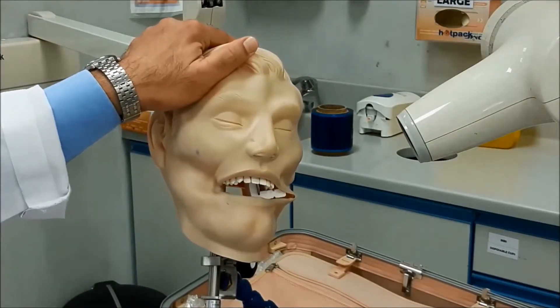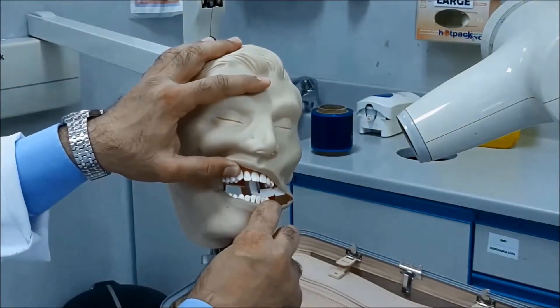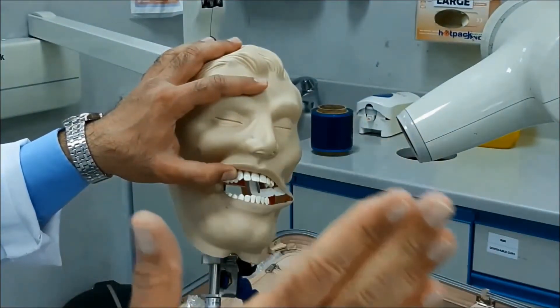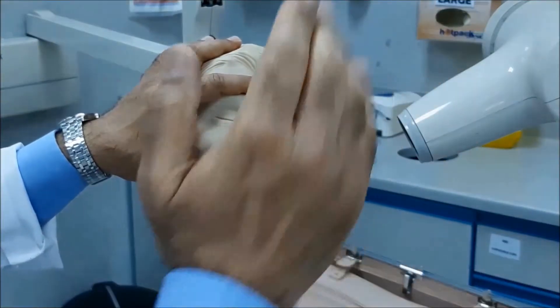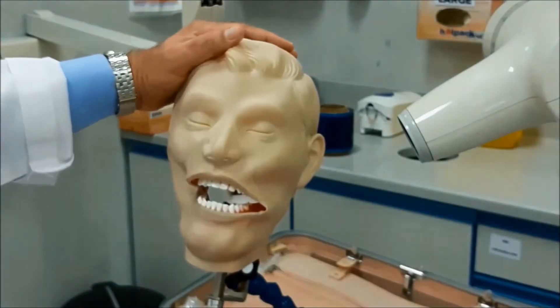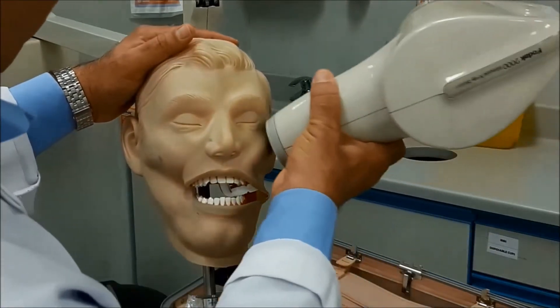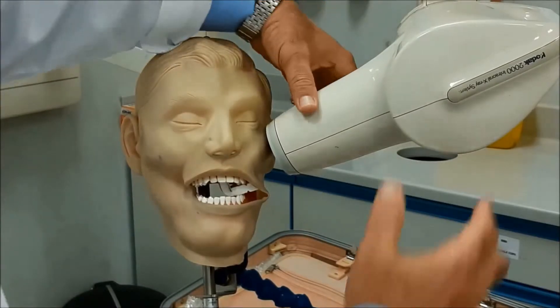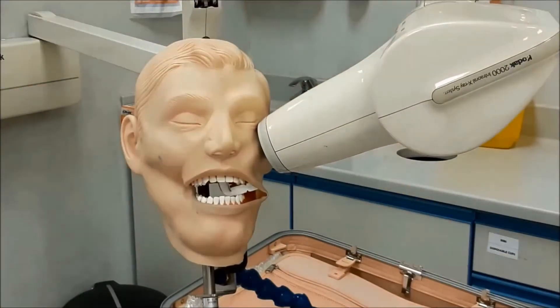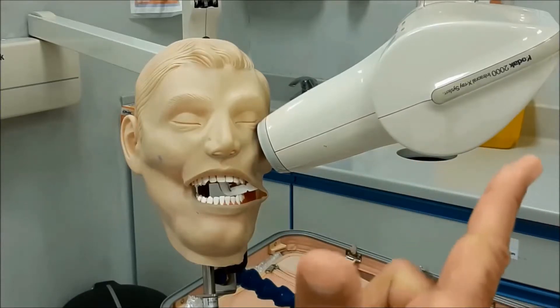From the side, you can see the second molar is biting and the relationship between the film and the tooth — the angle here is minimal. If you have a wide palate, the angle might be a bit wider. My point of entrance will be from the outer canthus of the eye down to the ala-tragus line. The vertical angulation is minimal — one, two, three.